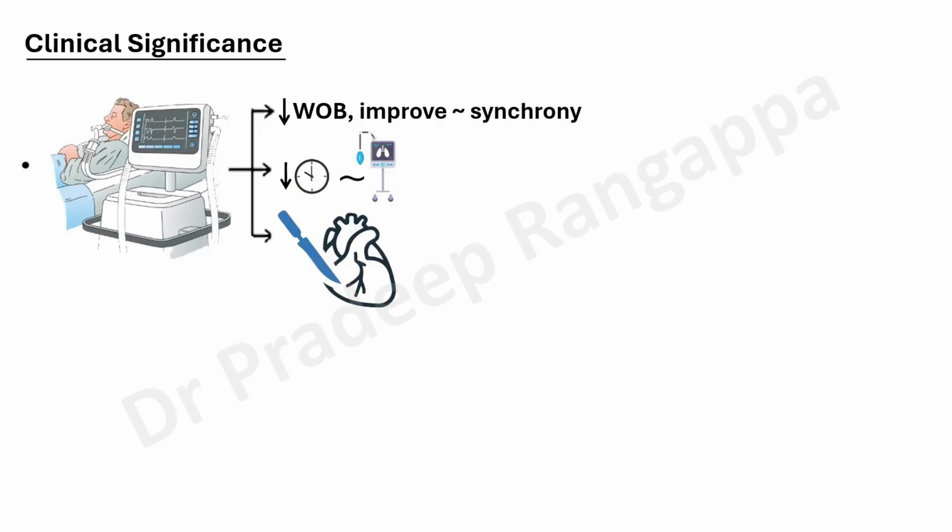There's one study which has shown that adaptive support ventilation in post cardiac surgery has shown early liberation from the ventilator and reduced the duration of ventilation. And this may be of interest for our intensivists. Adaptive support ventilation in a small study in pediatrics has been shown to significantly reduce the driving pressure when dealing with ARDS. And this is of importance to our intensivists.